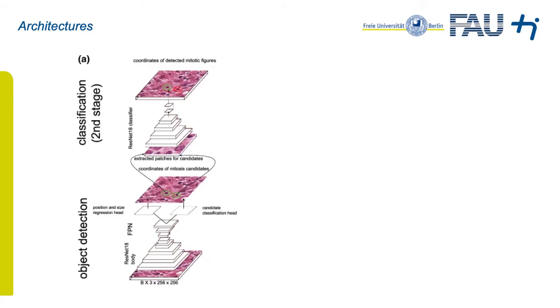The question of how to deal with mitosis as a pattern recognition task is actually not that easy to answer. First of all, you could say it's clearly an object detection task, since we want to detect mitosis, which are objects. Secondly, you could also say, no, it's actually a segmentation task, because we want to segment the area of those cells from the complete patch, and then we also know what percentage there is. Thirdly, you could also say it's a regression task. We want to regress the number of mitoses from an image patch. So we didn't make the decision at all and just evaluated all three possible tasks.